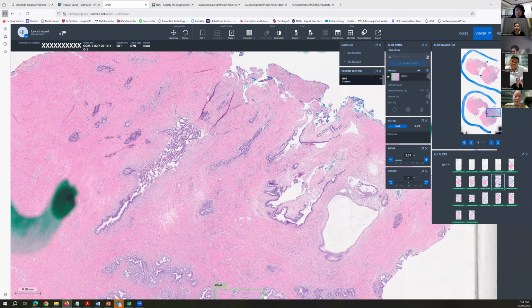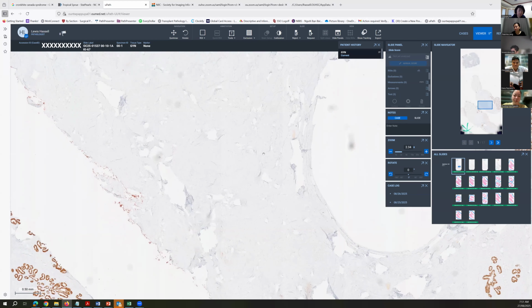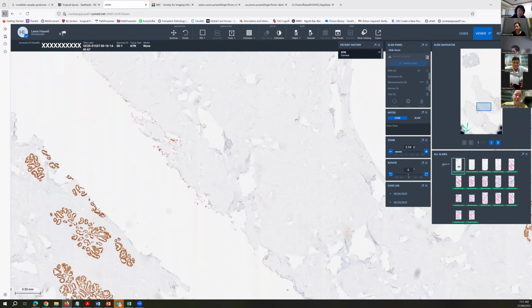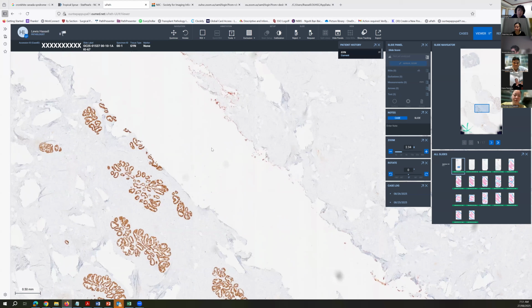Yeah, endocervical lesions are, I think, one of the scariest things in GYN pathology, one of the reasons being what you just showed, that they can be so subtle. For that area that had minimal deviation or adenoma malignum, I could conceivably see, if that was all we had and it was more towards the surface, having flown past it as normal endocervix.